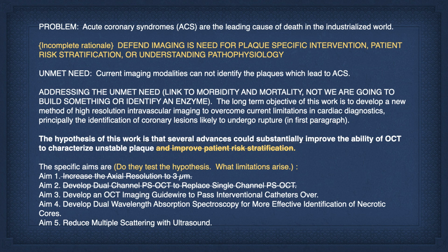Okay, I get tortured through the years by students or postdocs who say, "well, we can increase the resolution, we can increase the resolution." Increase the axial resolution to 3 microns. Do you have any reason to believe that you need to increase the resolution? Well, there's a lot of problems associated with increasing the resolution. So is there a reason that we can justify increasing the resolution? And I don't actually see why.